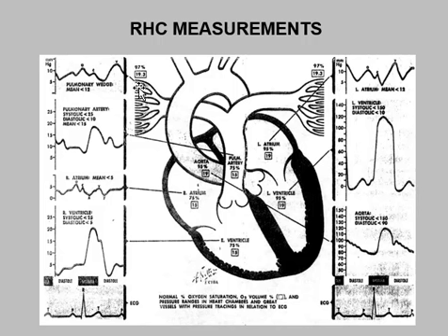So from the pulmonary artery with a right heart catheter, that's a much safer procedure that relatively less experienced operators can easily do, as opposed to a left heart catheter that's potentially very dangerous. You can obtain a very valuable physiological measurement, the end diastolic pressure. So understand, occluding that vessel simply means you're allowing the retrograde pressure from the left ventricle.